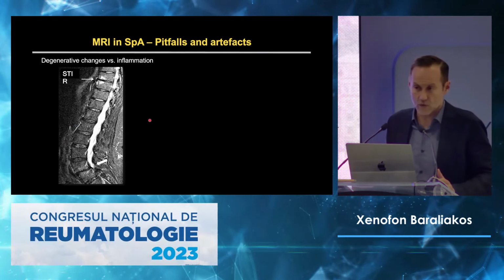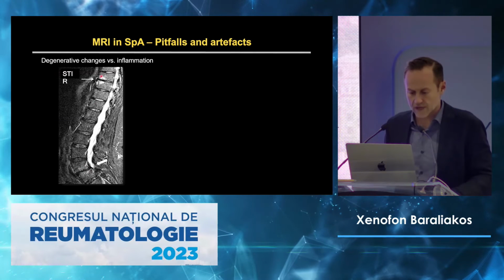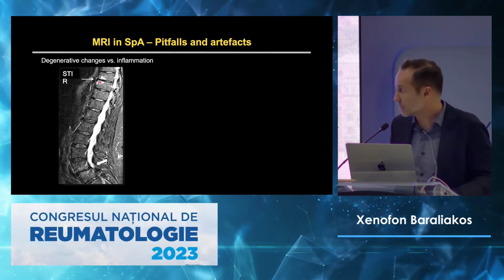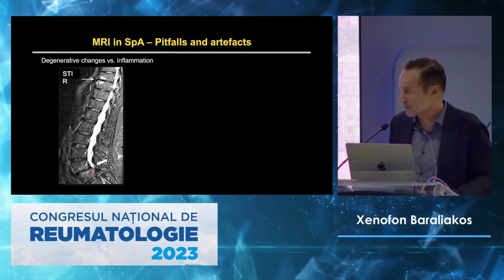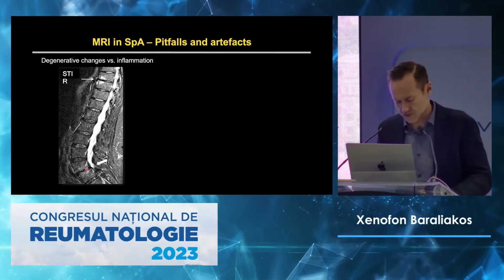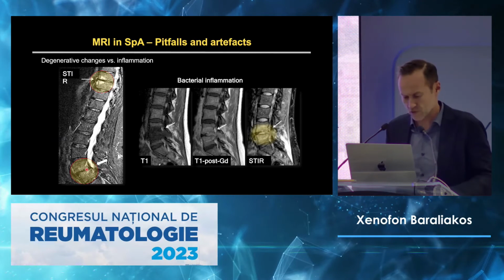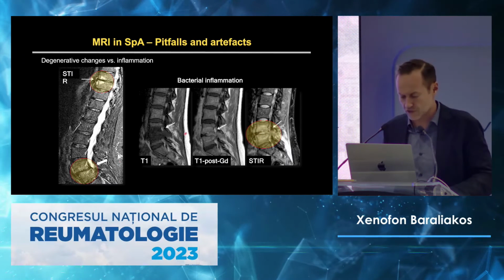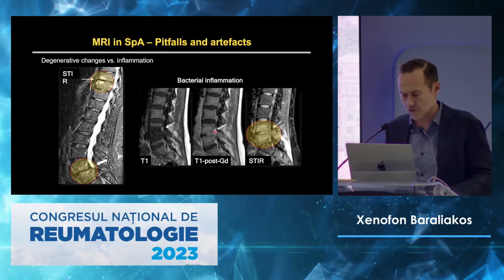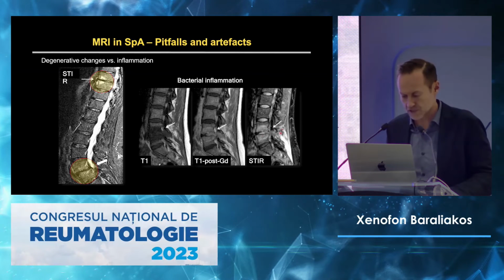And you may have a patient who has both. Yeah? He has degenerative changes and also spondylitic lesions. Yeah, that is SPA-like. This is the reason for having back pain now with the osteochondrosis as a finding. And the spinal bacterial inflammation looks like the one that I showed you before for the sacroiliac joint. You have the edema, it really goes away from the bone, and it affects the entire soft tissue. This is after surgery.